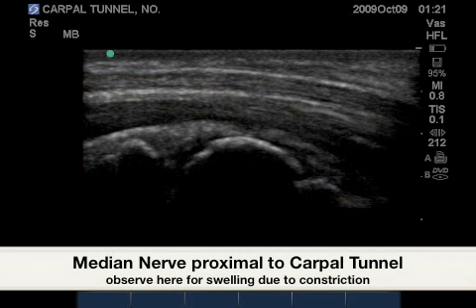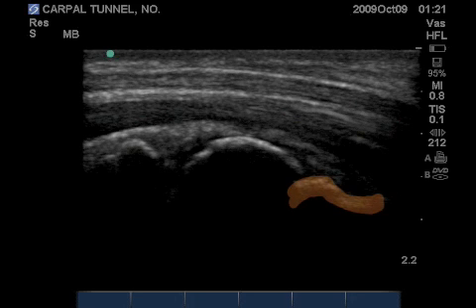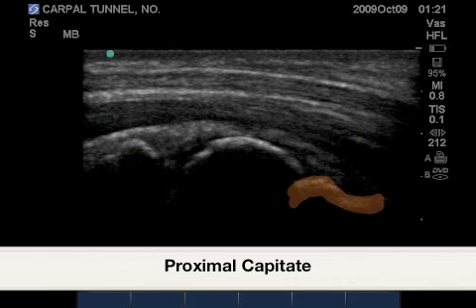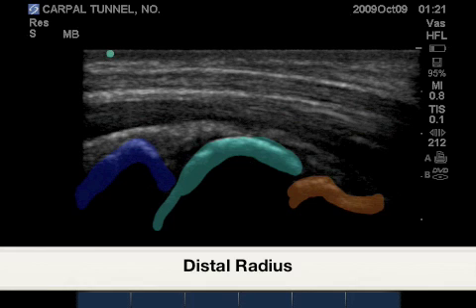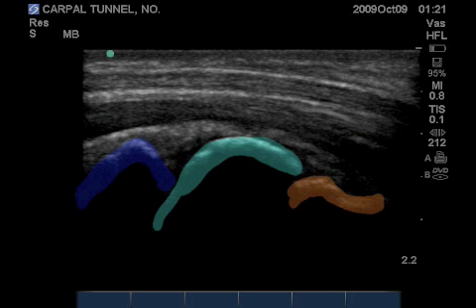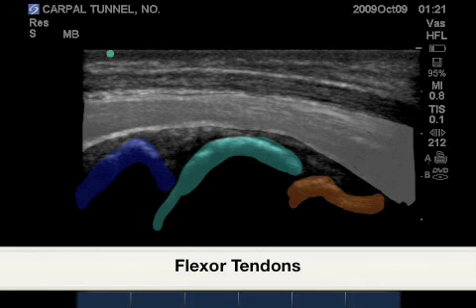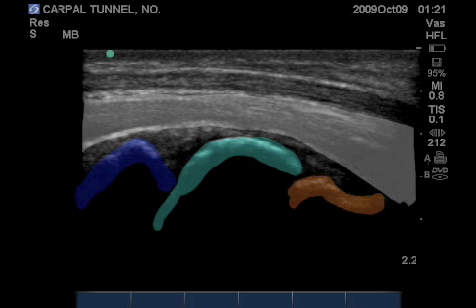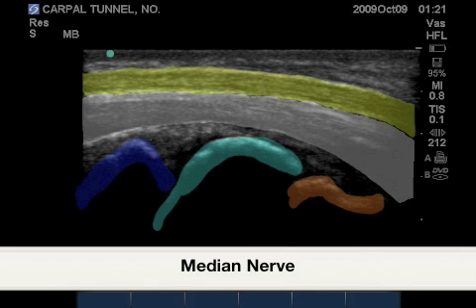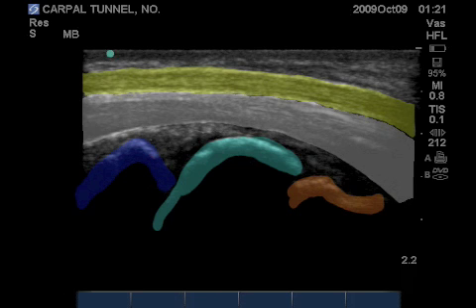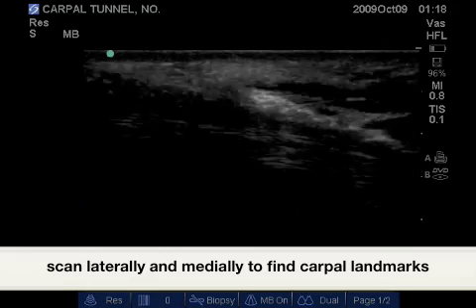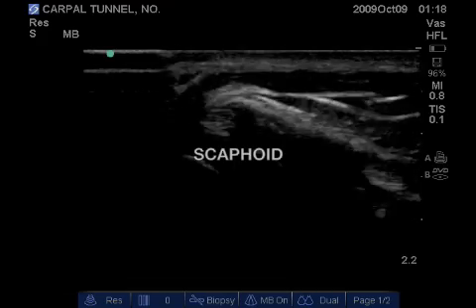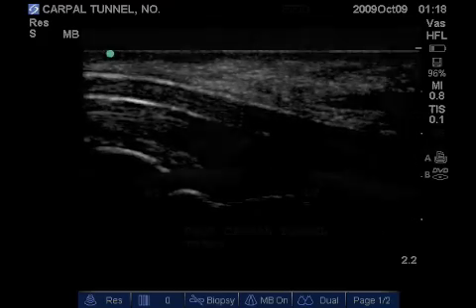Seen here is the proximal carpal tunnel. Highlighted is the proximal capitate surface, lunate surface, and distal radius in blue. We have the deep and superficial flexor tendons, followed by the yellow representing the median nerve. To confirm position within the true carpal tunnel, scan medial to lateral for the bony prominence, such as the scaphoid surface or pisiform.